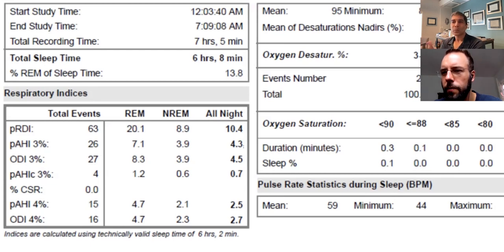I think that's what's important to distinguish between someone with a high AHI versus a high RDI. Now, the high AHI person can have all those things, but if the AHI is low, people get blown off. But the reality is that RDI can cause that pressured feeling in your body, loss of balance, because we all seek balance in the end.